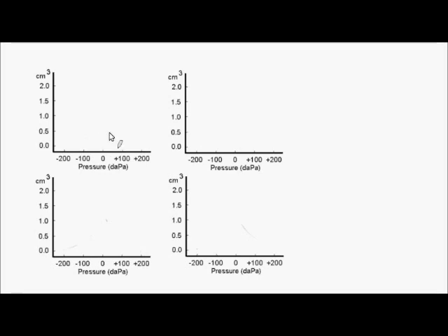Tympanometry measures the compliance or stiffness of the tympanic membrane. This is done by putting a probe in the ear, which contains a tiny speaker, microphone, and an air pressure changer. The probe emits a tone at 70 decibels and then blows a puff of air into the ear. The probe measures how much sound is reflected back by the eardrum during the different air pressures.